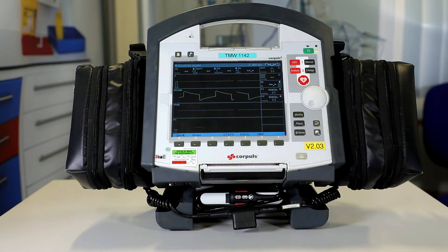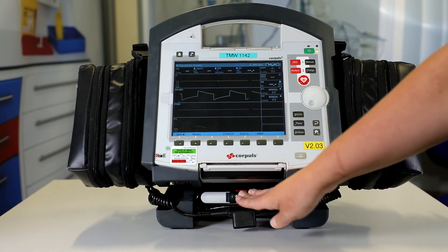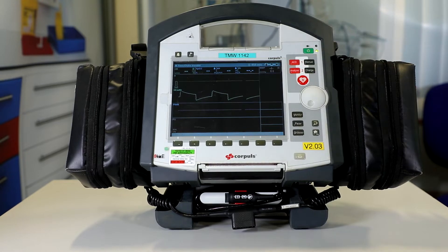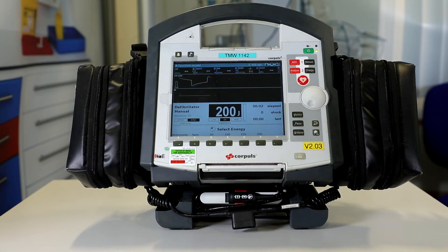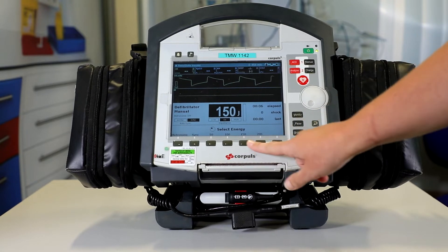So for check one, first ensure the master cable is plugged into the contact socket — give it a good push in and confirm it's in. The next thing we do is select the manual button, and we're going to ensure the soft key functionality by pressing the 50, 100, 150, and 200 joule buttons.